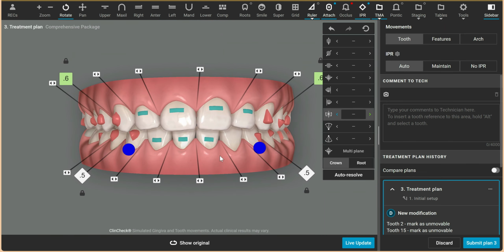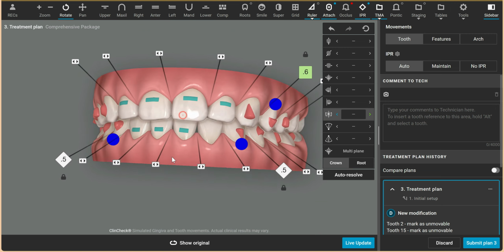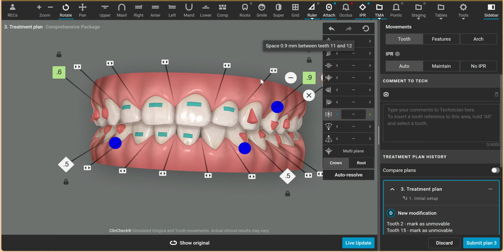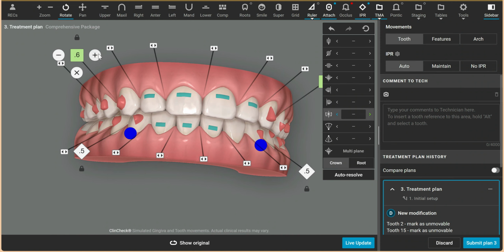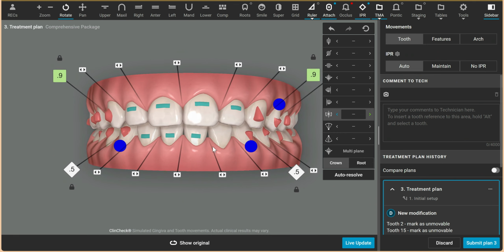Keep in mind, in cases like this, when there's a deep bite, retroinclination, lingual inclination, and spacing, usually the amount of overjet you see after the initial set of aligners is less than what you see here. So I'd probably go like this again, bring it back up, and go with it. And then in refinement, after the initial set of aligners, perhaps I can adjust the amount of space that I left distal to the upper cuspid teeth.